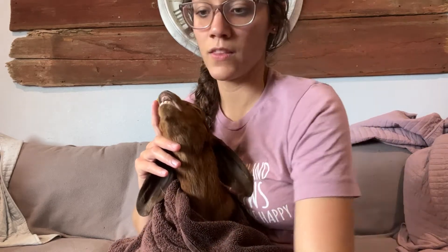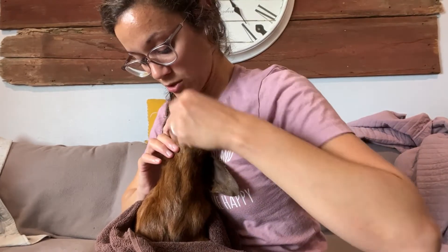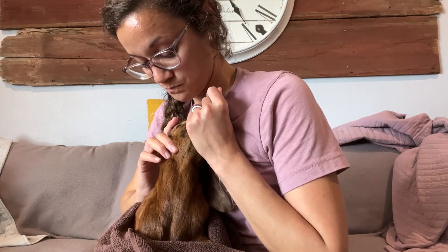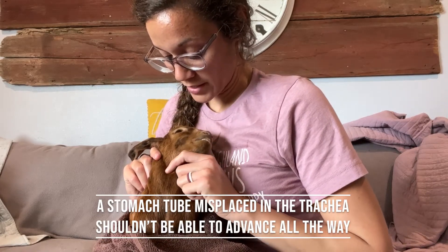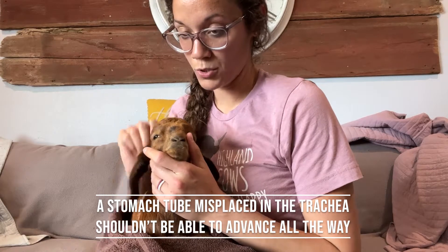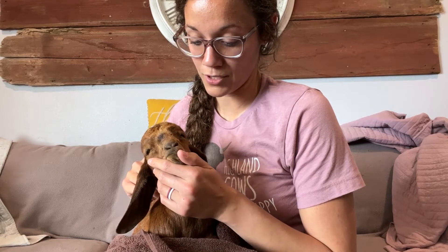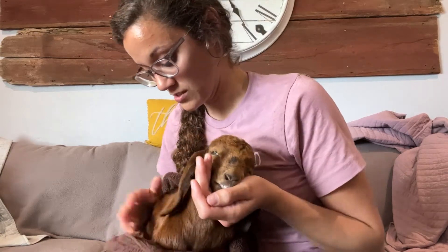When you start putting the tube in, they'll swallow and it'll go down the esophagus and not the trachea. If it goes into the trachea, you shouldn't be able to see it — when you insert the tube correctly, you can see it kind of move down the left side. Always feel before you push the fluids to make sure they're not going into his lungs. When you start pushing the fluids, check: is he coughing? Does it seem like it's in the wrong system? With thiamine deficiency, they'll have nystagmus in the eyes, so the eyes will kind of twitch back and forth.